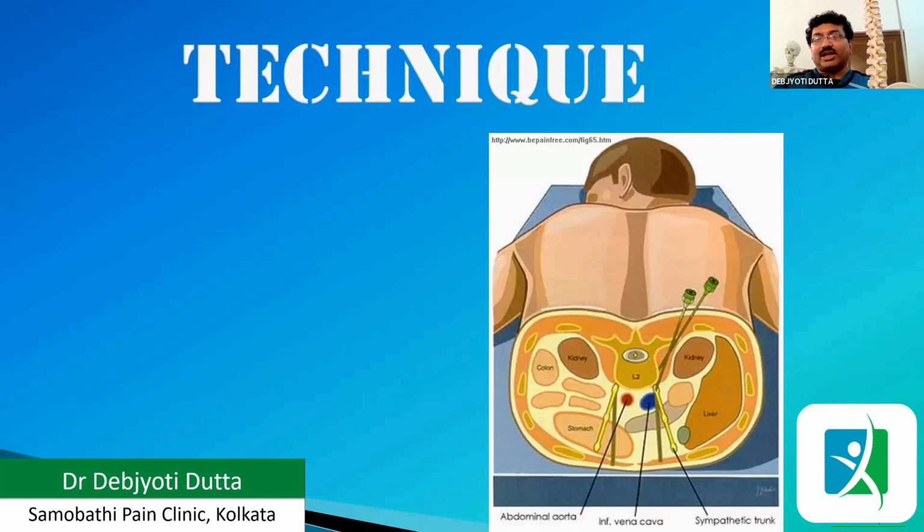If you are injecting neurolytic, if you are using alcohol especially, then before giving alcohol you have to give the local anesthetic injection. If you are not using alcohol, if you are giving phenol, there is no need to give an analgesic beforehand. Then you inject 6% phenol, and inject a very small volume, 0.5 ml of normal saline, so that the needle is washed of phenol, and then take the needle out.